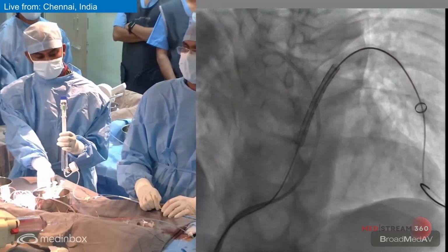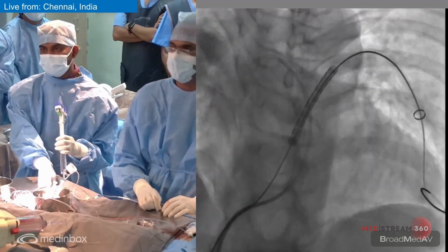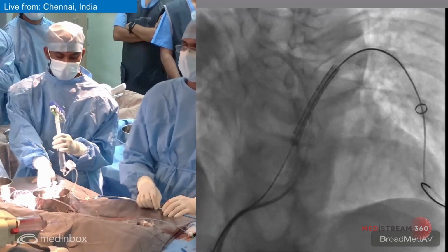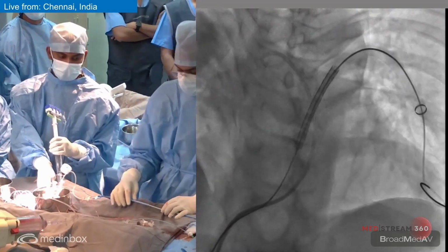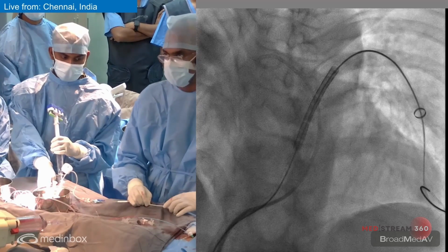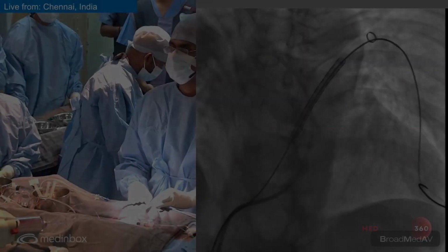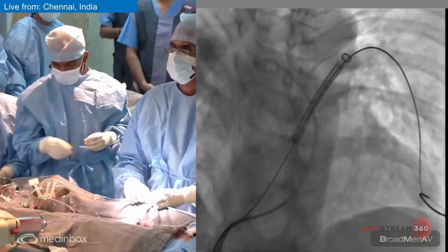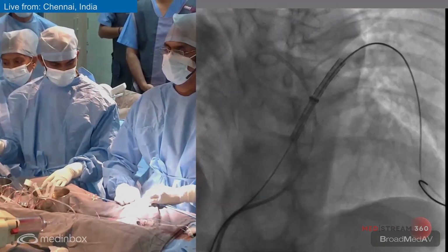The target was partially across the left pulmonary artery and partially across the main pulmonary artery. So I'm going to peel back the sheath in order to expose the stent. So I'm withdrawing the sheath.